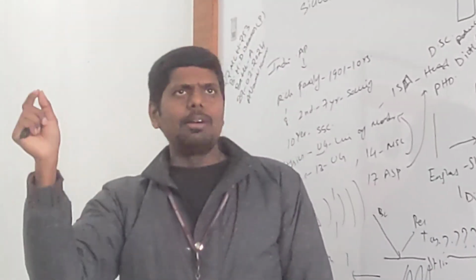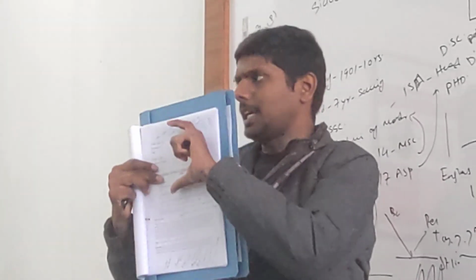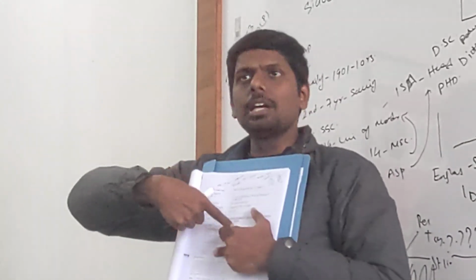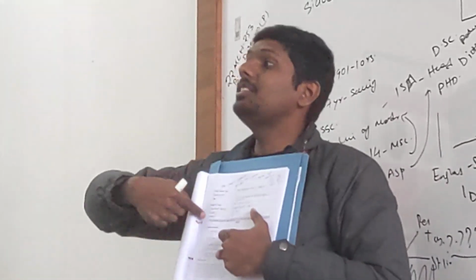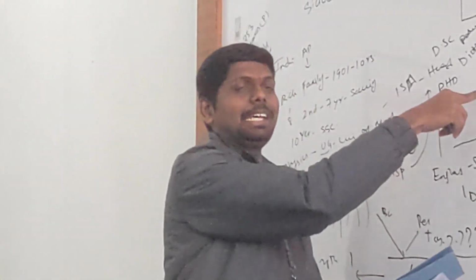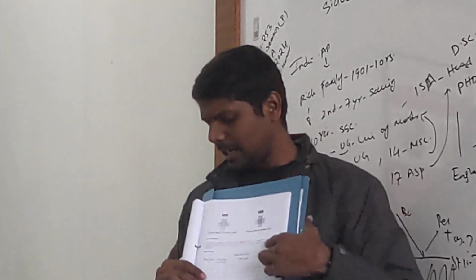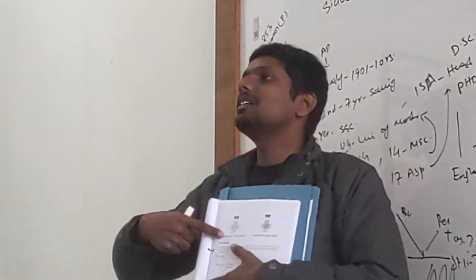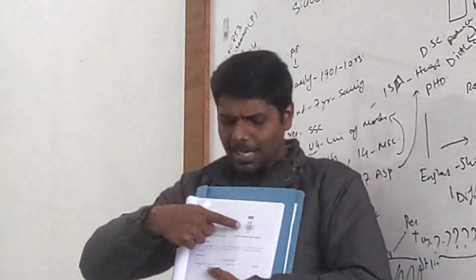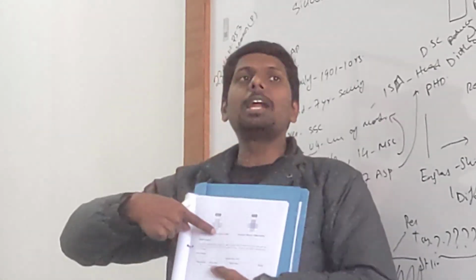Okay? So, I will give you one example. There is a ruled paper and I keep a normal water test tube and an aloe vera gel tube. In water you can see the lines, whereas in aloe vera gel, the background lines won't be visible. Got my point? Similarly, in the sickle test, the blood becomes turbid. So what happens in sickle cell anemia? The lines will disappear. Disappearance of lines indicates positive for the sickle test. Appearance of lines indicates negative for the sickle test.